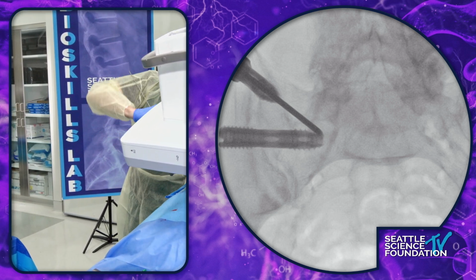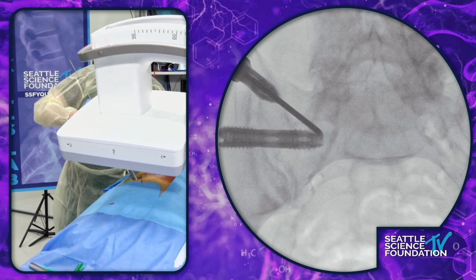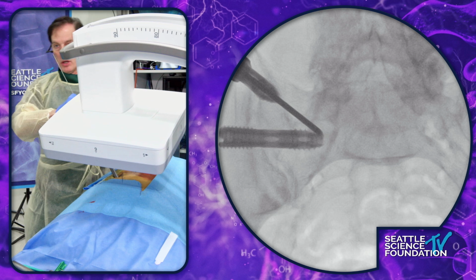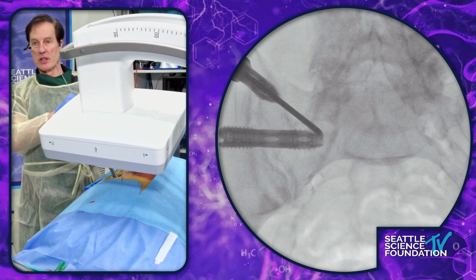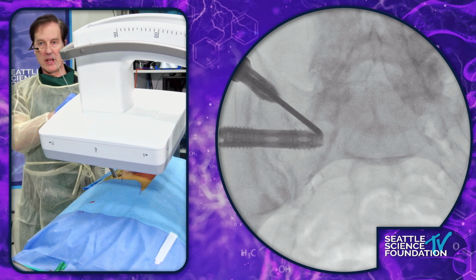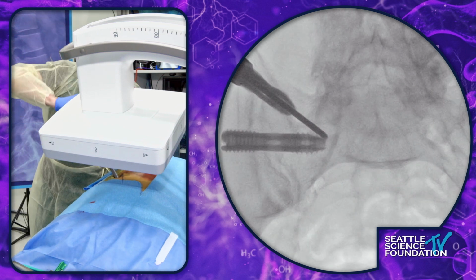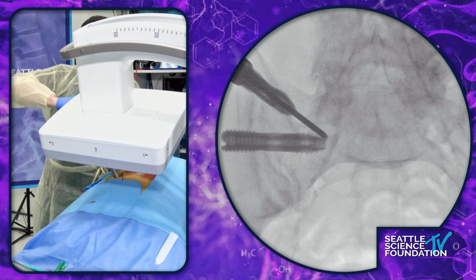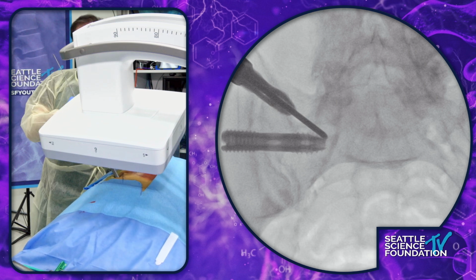It's right along the anterior margin, which we are really not aiming at, but in some pelvises you'll have a posterolateral screw that aims toward the trunk, and you just need to make sure not to let that pin advance, and not have the screw be too long, which is just a technical error because we will have measured the size of this screw.